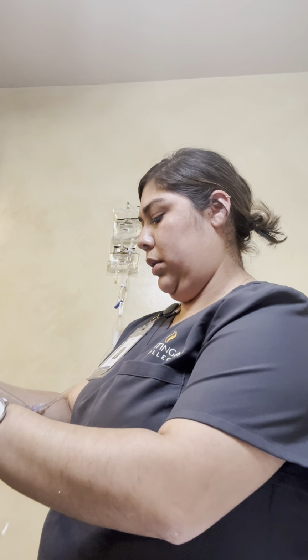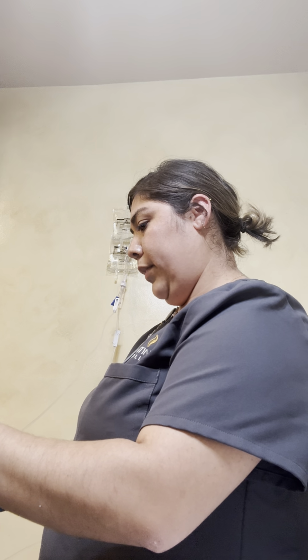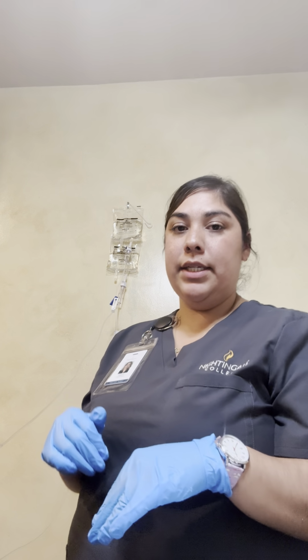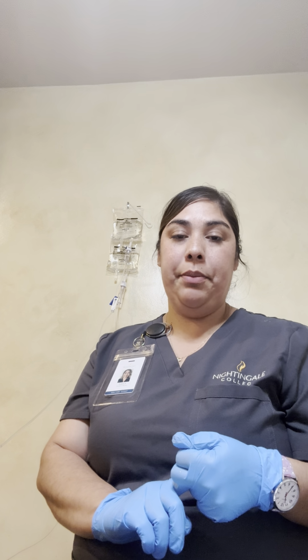And I'm gonna screw this over here. And we will connect. So they're already connected. We already verified the 38 drops per minute for the fluid, and the 100 drops per minute for the amoxicillin.